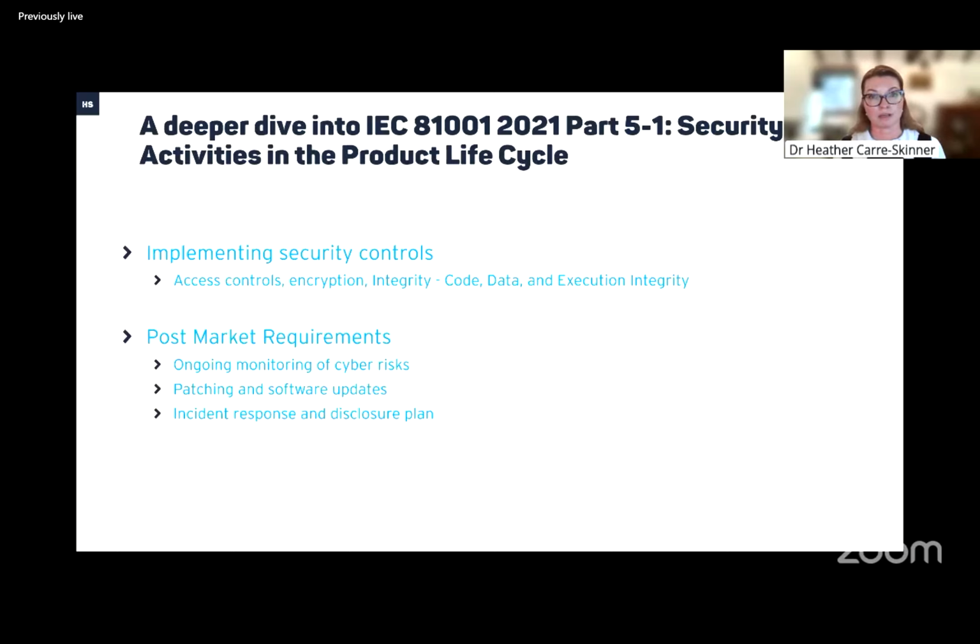So looking at something like a similar device, looking at how your device will be patched if need be, as well as software updates. So this is part of the maintenance plan for a software device. And also an incident response and disclosure plan as well.